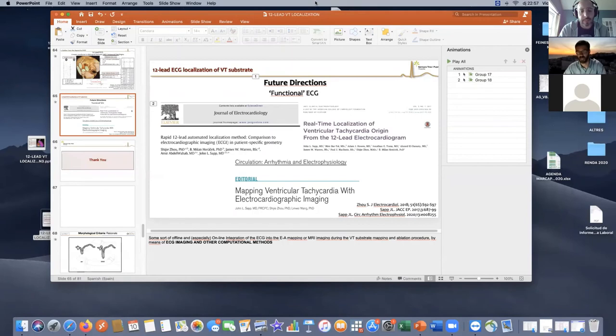Yeah, and that brings me to my next question regarding QRS fragmentation, because beyond localizing extensive scar in someone with arrhythmogenic right ventricular cardiomyopathy or someone with an extensive non-ischemic cardiomyopathy, we always look at improving our metrics for risk stratification in ischemics, but especially non-ischemics.